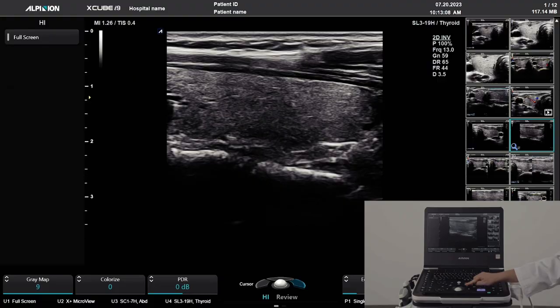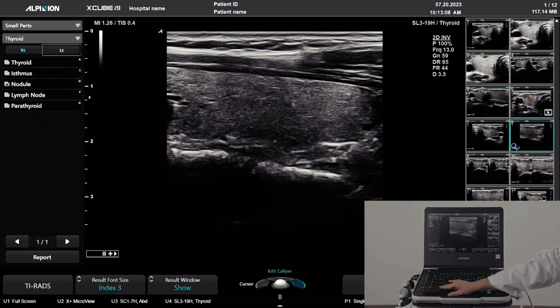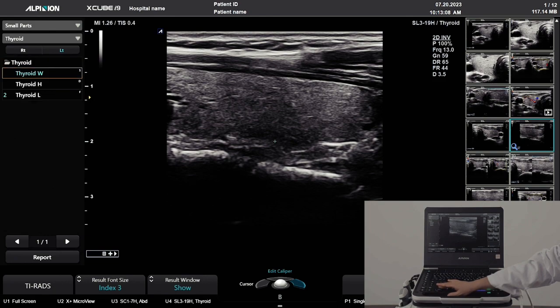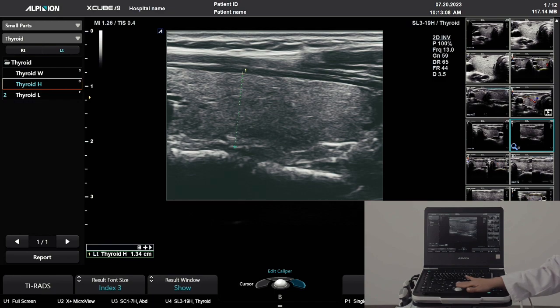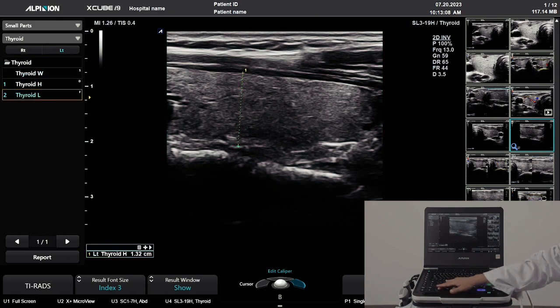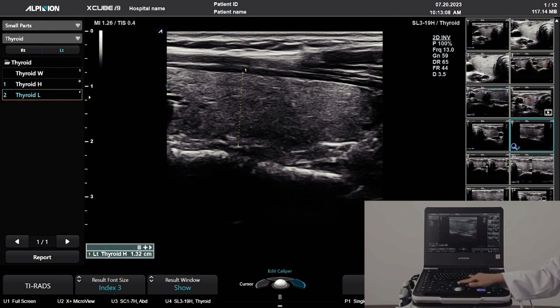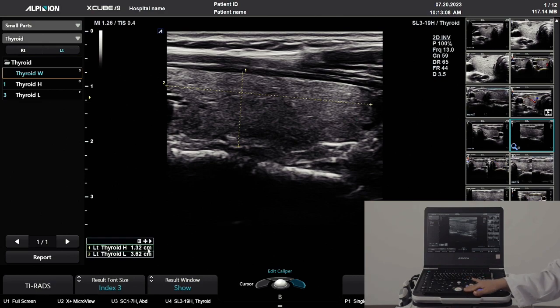Open the measure or caliper function. With the measure key, you can select a calculation package for a specific application on the left monitor. Select a measurement item with the select key. Once the crosshair cursor appears on the monitor, place the cursor where you want to measure using the trackball and set button. A mini report pops up on the lower right of the monitor. To delete a specific value, select the value with the trackball and set key, then press the clear key.